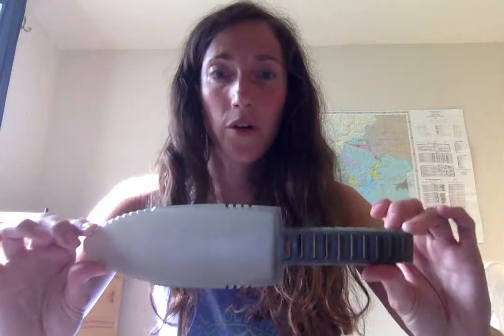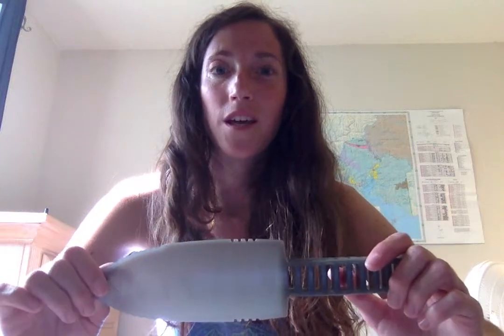When I first got my ostomy and started back to day trips and overnights, I just kind of continued with what I had done before having an ostomy, and that was digging a cat hole to go poop in. And so this time, rather than pooping into the cat hole, I would be emptying my ostomy into the cat hole. So for that, I brought along a little shovel like this one.